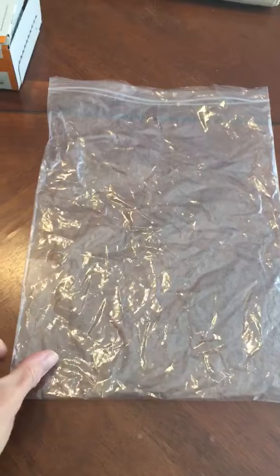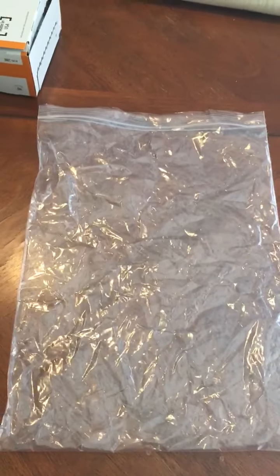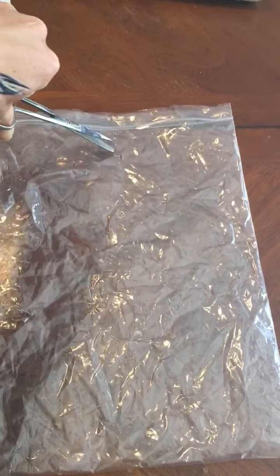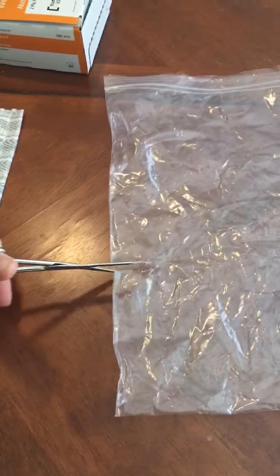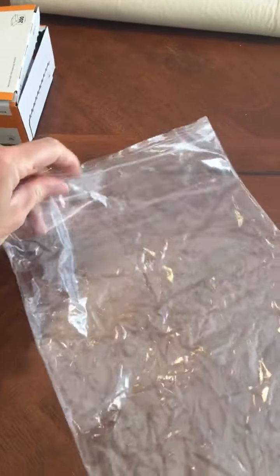You take this plastic bag that you get in the delivery. I cut two holes in it — one hole on top here, and another hole over here as well. Then, pretending that this box of alcohol wipes is my pump, I would place it in the bag.